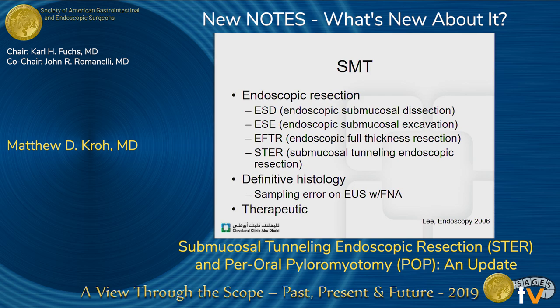So if we look at this smattering of acronyms, it gets to be quite confusing, there's local regional preference in terms of what all this means. For STER, submucosal tunneling endoscopic resection, we're really looking at submucosal tumors, and I'll talk about that in a bit, but we're looking at endoscopic resection. And there's different ways to access these tumors of the GI tract, and I'll mainly talk about upper tract lesions. Endoscopic submucosal dissection is really a mucosal-based technique, but really spurred a lot of the intramural surgery we'll talk about in this section. Endoscopic submucosal excavation, endoscopic full thickness resection, which I think is one of the upcoming talks, and then I'm going to talk about STER, which is submucosal tunneling endoscopic resection.